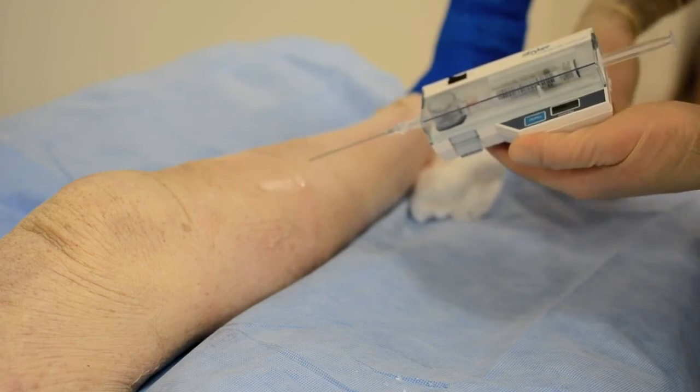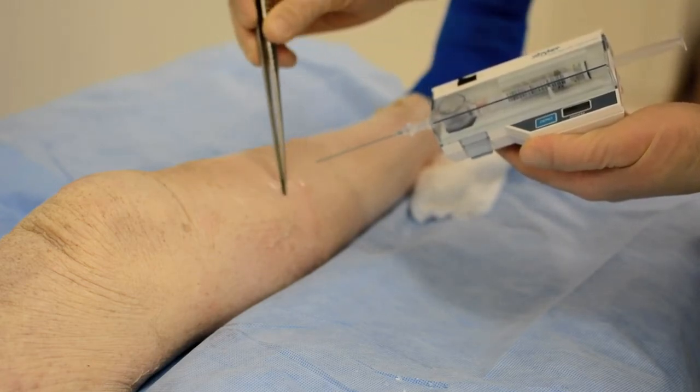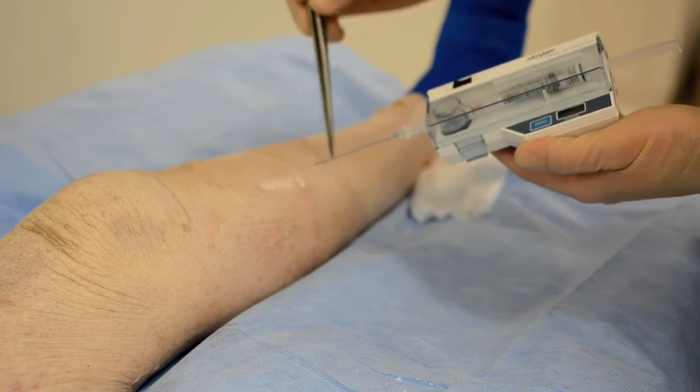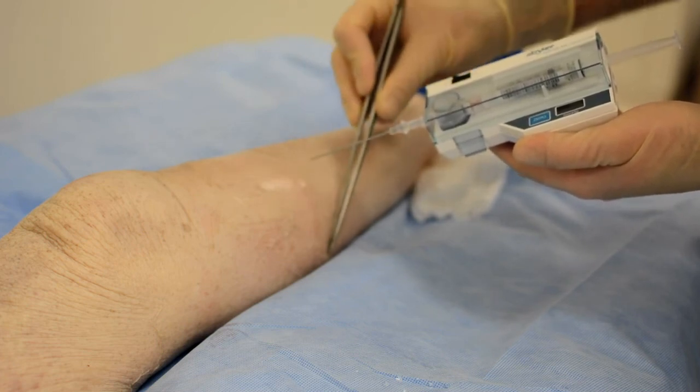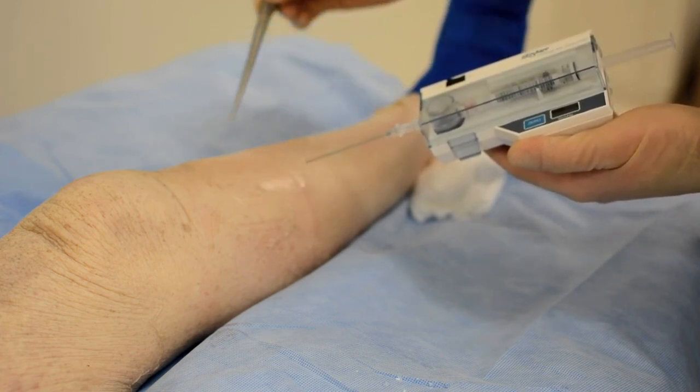After you have obtained your reading, you will need to check multiple readings within the same compartment as close to the fracture as possible. And then you will also check all four compartments, also multiple readings.